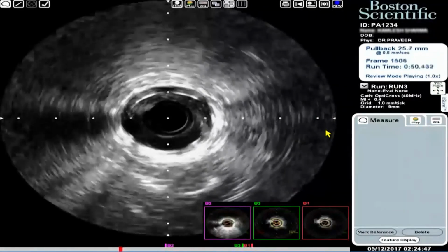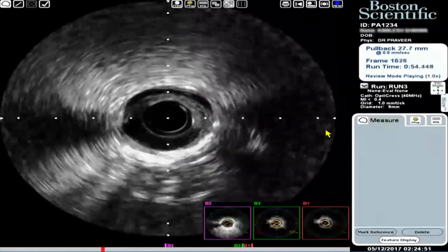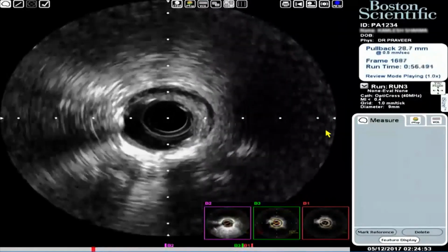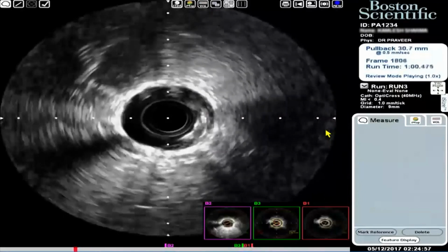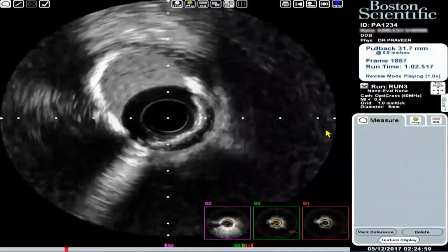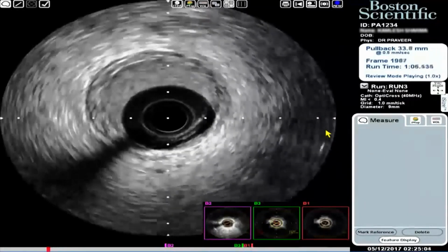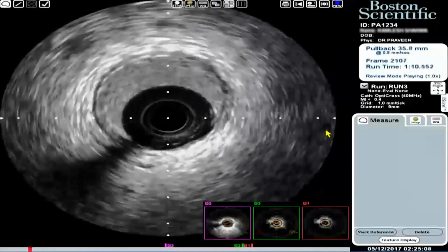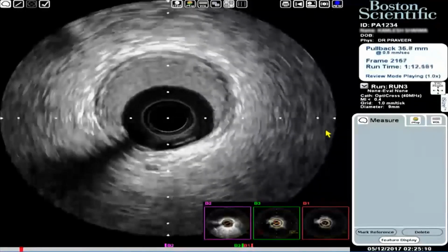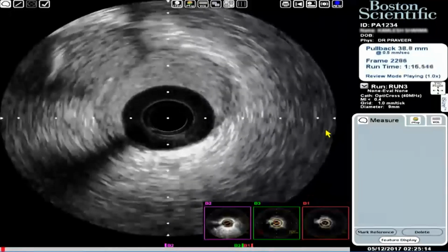The whole length of the stent is underexpanded, so you have an outflow plaque disruption in a small vessel. You have a 2.0 stent which is underdeployed, and the proximal 2.5 stent is also underdeployed in a large proximal circumflex, which is a recipe for further events. You've already had one event, and acute occlusion is a risk.